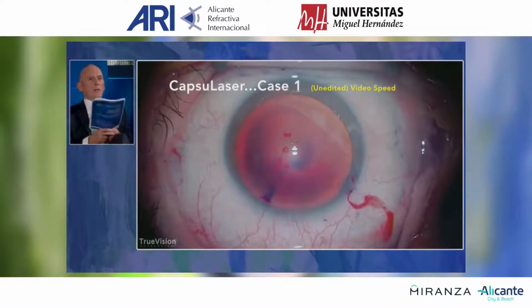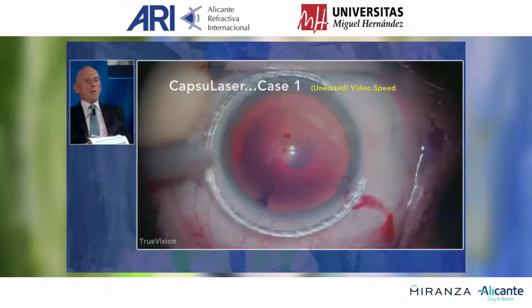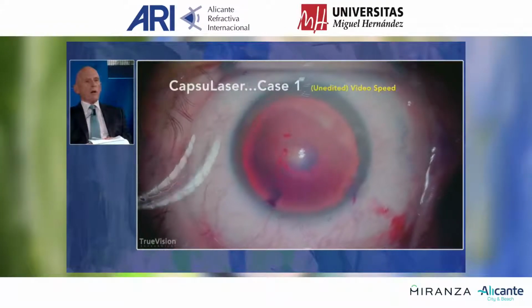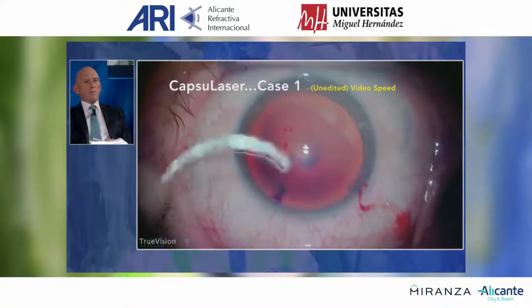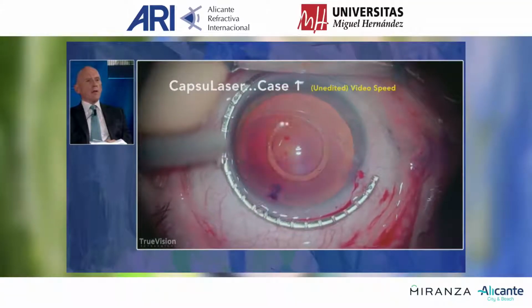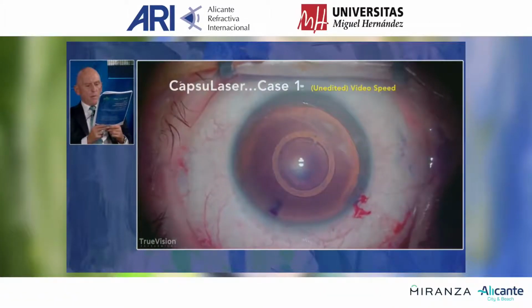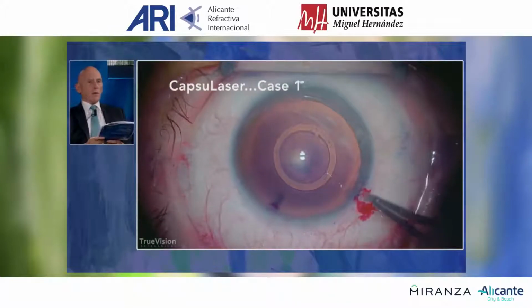That is a very simple device just to center the eye. We are centering in the most stained part of the capsule, which is coincident with the second Purkinje image. In other words, we are using the Purkinje image in order to guide our procedure. We are showing you how we use the Thornton ring, and now we are centering, and once we feel that the center is there, then we push, and in only 25 seconds, we do these 5 millimeter capsulorhexis.